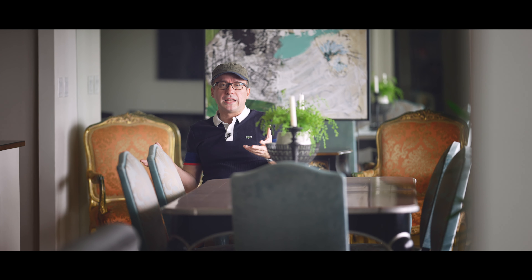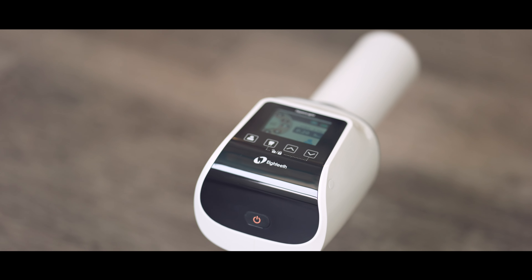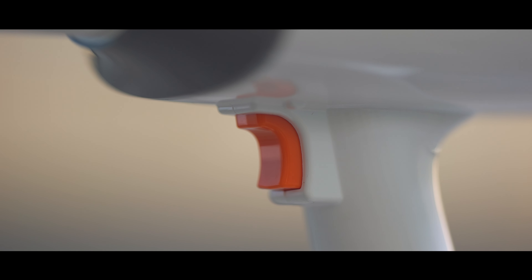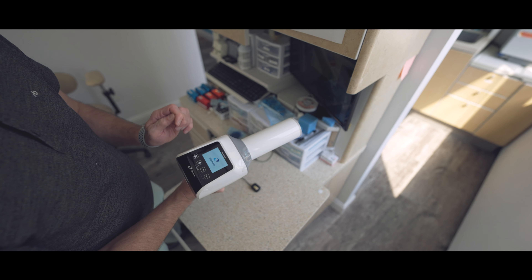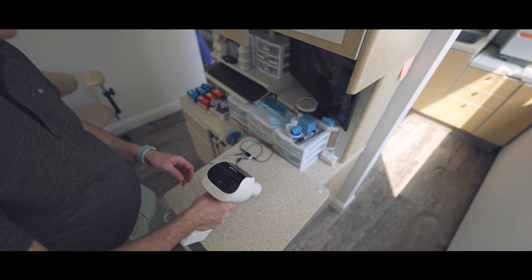In terms of the quality of the image that you get, it's just an x-ray production head. The advantage of this particular unit, from what I gather, is that it's a nice slick, streamlined little unit. The looks and design are very nice, but most importantly when it comes to these devices, it's the weight that matters — because whether it's you or the assistant doing it, after taking a few x-rays it could get pretty heavy on the hand. So you benefit from having lighter x-ray production heads. This particular unit is much lighter than the original Nomad that I've had experience with, which is much heavier. The images I got out of it in my tests were acceptable and perfectly equivalent to the x-ray head I have on the wall.